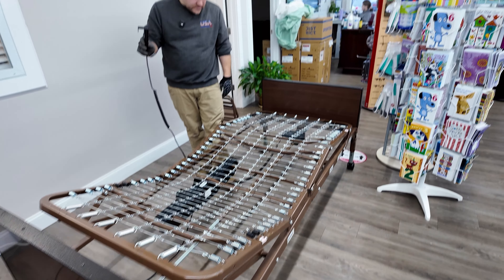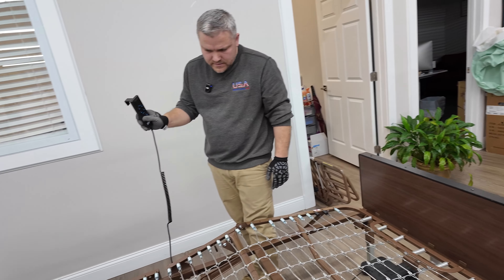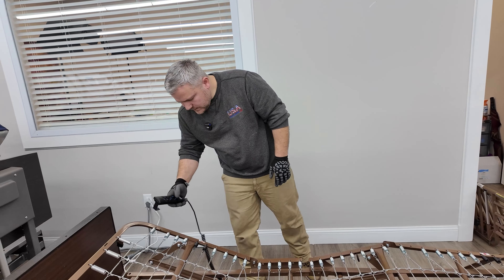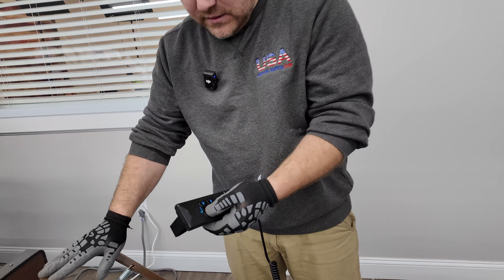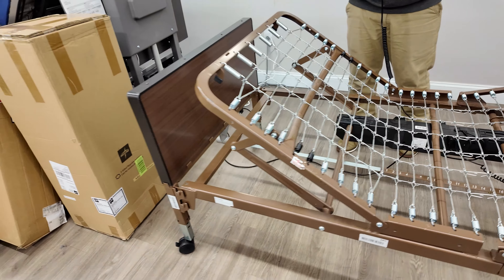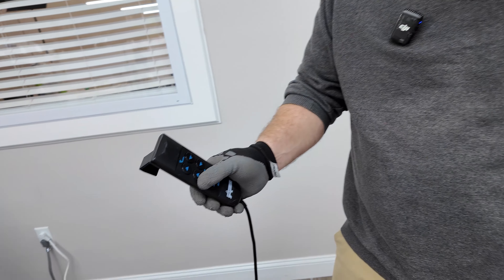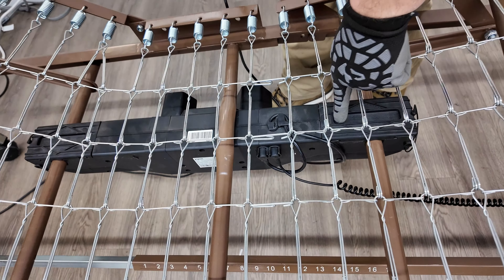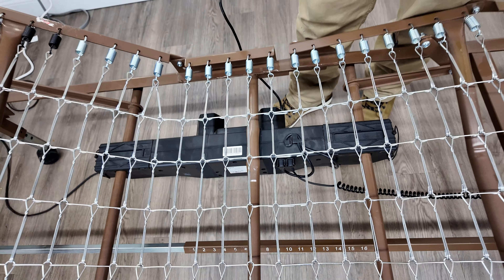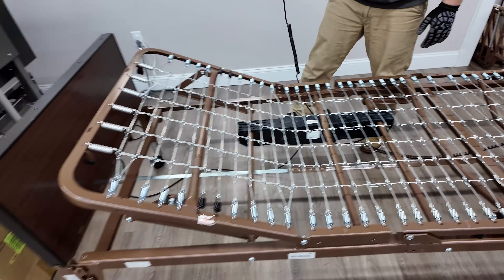At this point you can test how high it goes and confirm everything is working. Test the head up and down, same thing with the knees. The first time you activate the knee function it will take a little while — you'll hear the motor but nothing will happen immediately. That's because the white actuator takes a bit of time to start pushing. Just be patient and keep holding the button; at some point it will start to move.